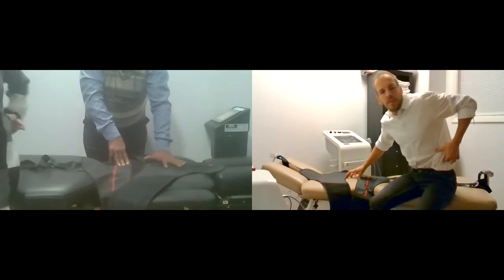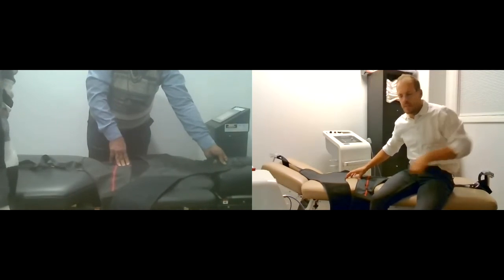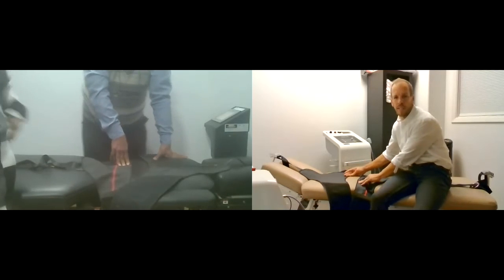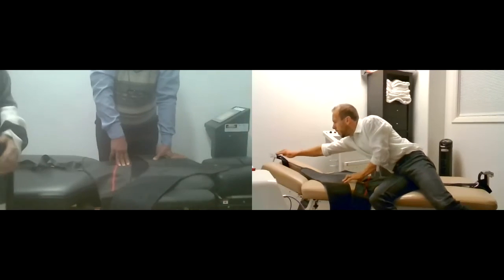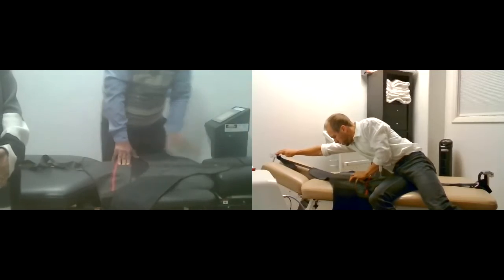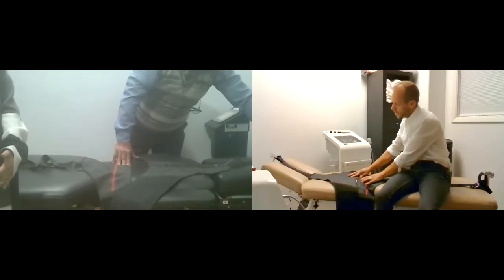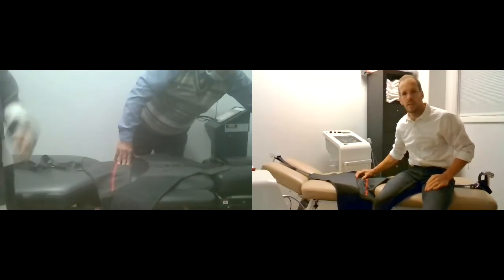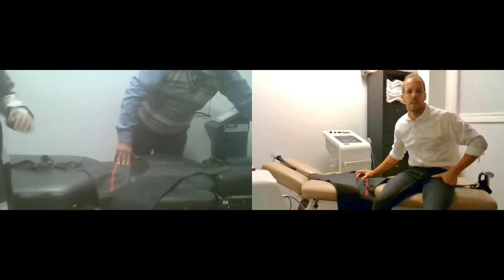So if a patient is very short, then this thoracic harness is going to slide all the way down. So you would loosen it up here, and these two red tabs would be touching each other.